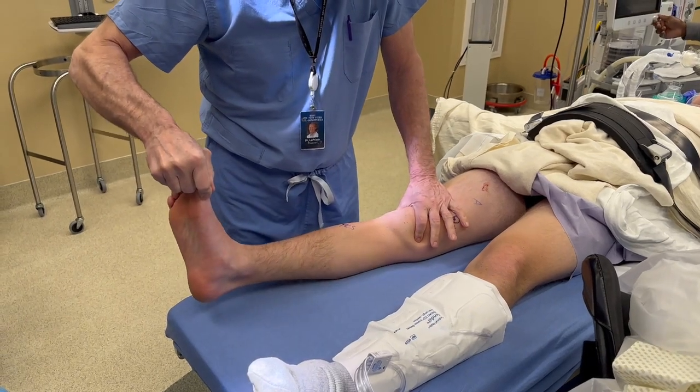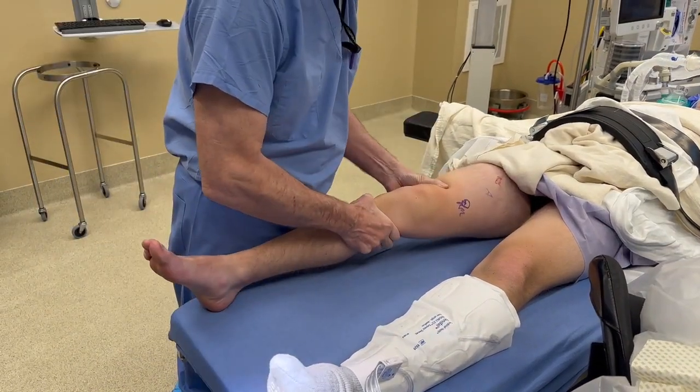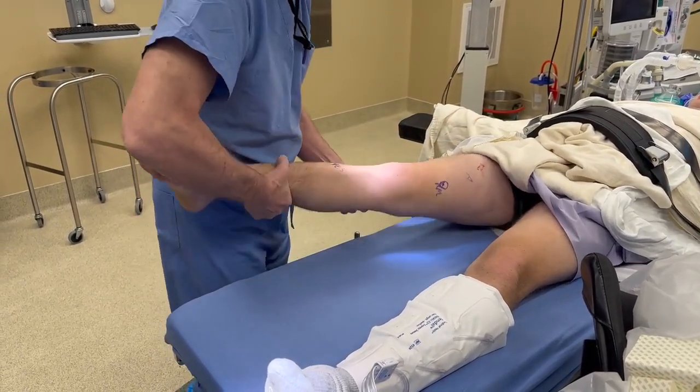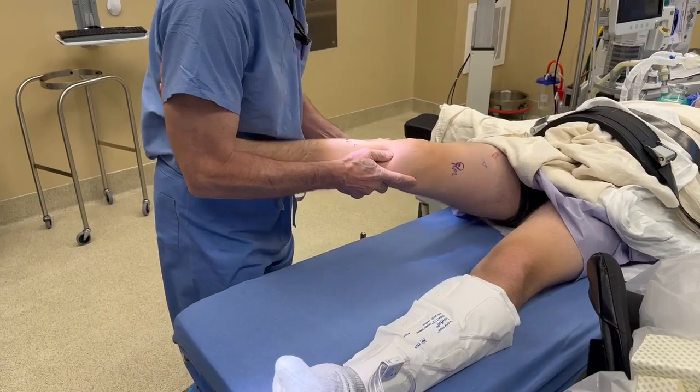The patient is brought into the operating room and induced under general anesthesia. A knee exam under anesthesia is performed to validate the clinical exam findings including Lachman, pivot shift, and various stress exams.